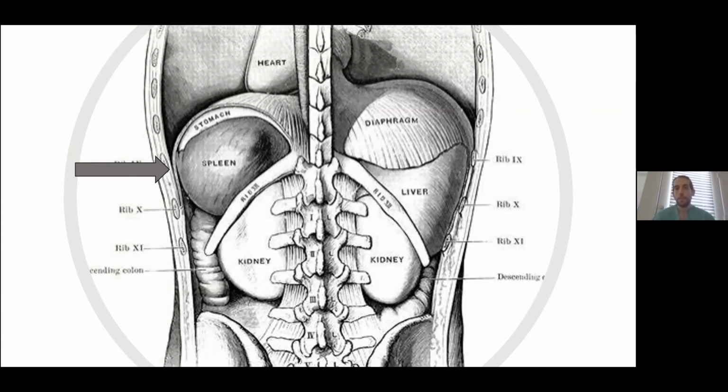What you can see with contrast enhanced ultrasound is the spleen, the liver, and the kidneys relatively well. What you cannot see is diaphragmatic injury, which, I mean, even CT can miss. Intestinal injury, CT can miss as well. The stomach and the pancreas are things you're not going to be able to see very well on contrast enhanced ultrasound. Retroperitoneal structures are also difficult, especially considering the pancreas is mostly retroperitoneal, but really anything in the retroperitoneum is going to be difficult to see because you can't visualize it very well.